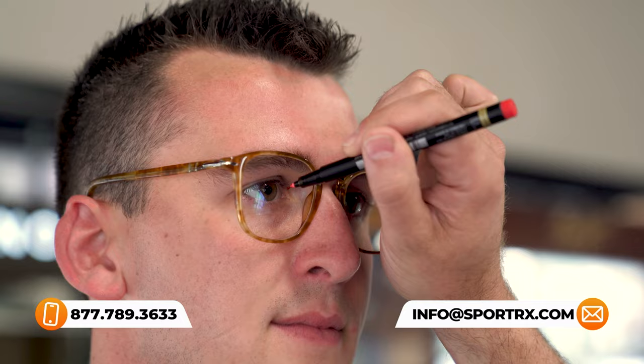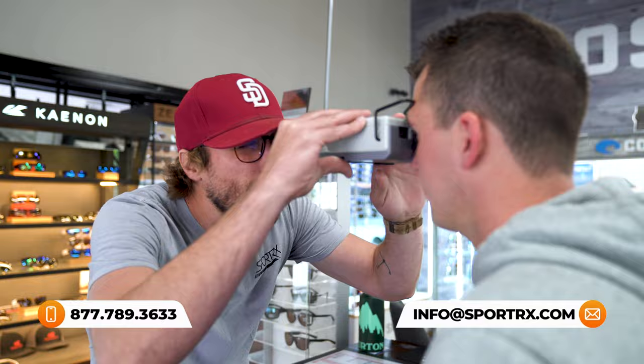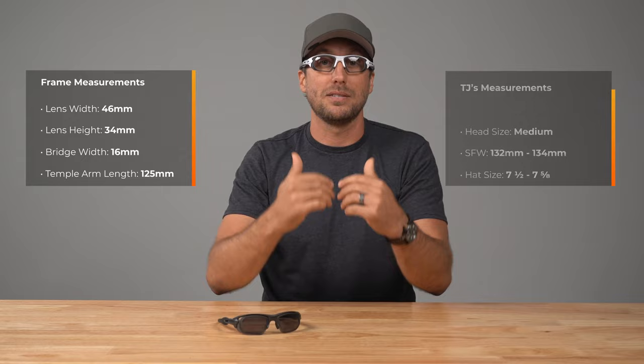By the way, it's available in single vision, progressive, and in some cases even a line bifocal. Now, I'm going to try these frames on and we'll include the frame and lens measurements over here. And to give you an idea for scale as it relates to fit, I'll include my physical sizing specs right over here.